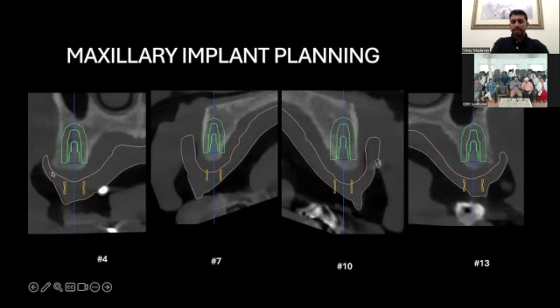Sometimes if you're using an immediate denture, because the tissues shrink over a period of time, you always want to do a wash impression, such as a PVS wash impression, before you place these markers. If your denture is not stable, the guide that is printed later on is not going to be stable either. The most important thing is to make sure there is intimate tissue adaptation of the existing prosthesis. If you're doing an immediate denture, because the tissues shrink after delivery, you want to do a new wash impression before the patient obtains a CT scan.